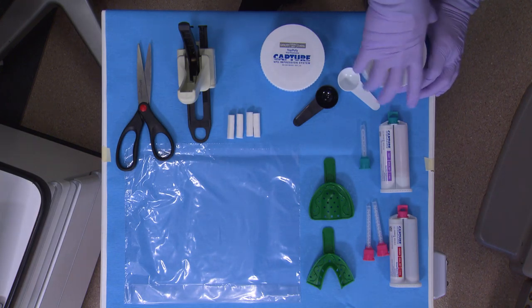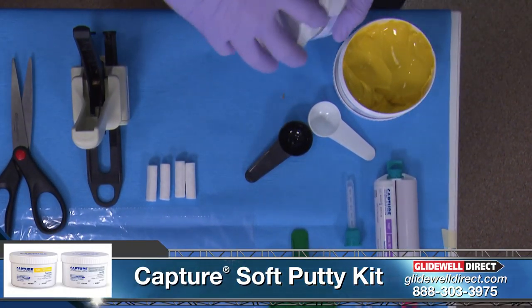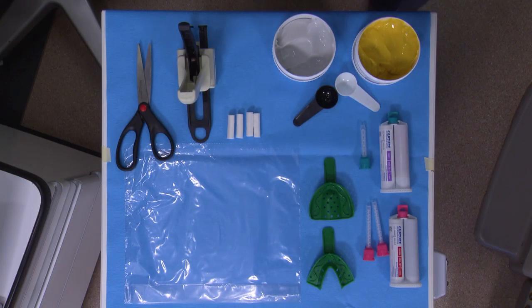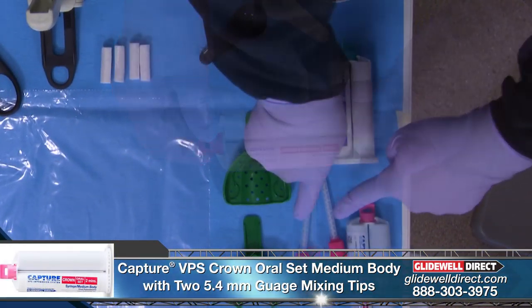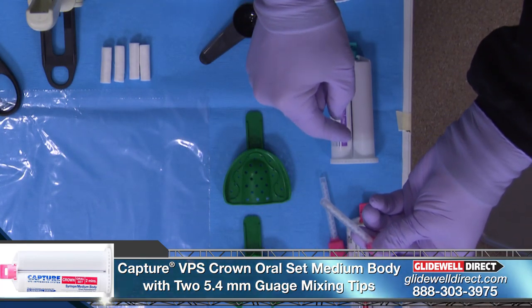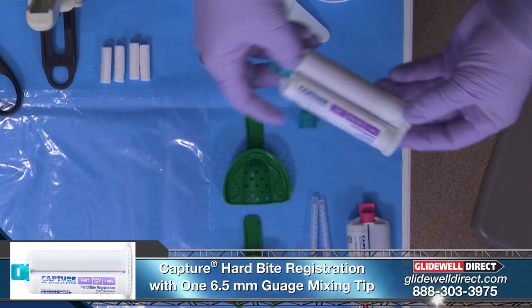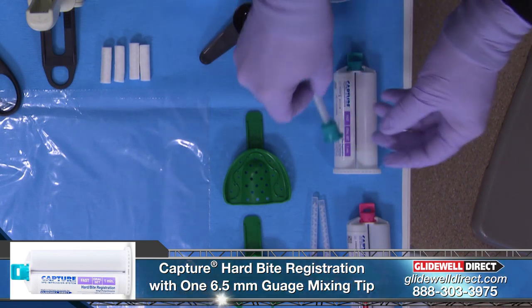Your setup for this impression should include the Capture Soft Putty Kit — a basin catalyst kit complete with two spoons for an even one-to-one mixing ratio. Also, a Capture VPS Crown Oral Set Medium Body Syringable material, including two mixing tips. We prefer these tips to be in the 5.4mm gauge size. Also, the Capture VPS Fast Oral Set Bite Registration Paste with just one mixing tip, which we prefer in the 6.5mm gauge size.